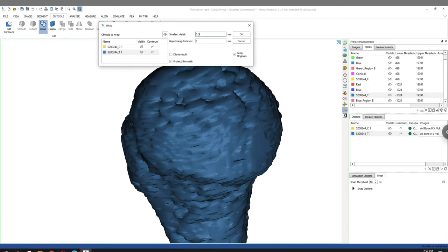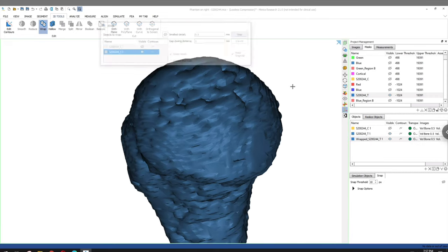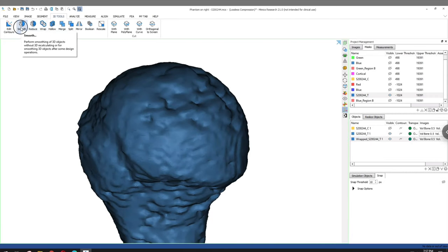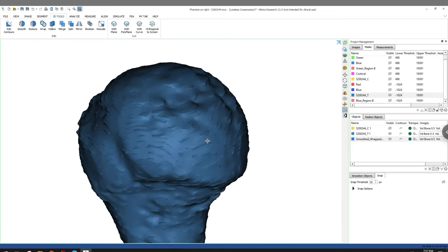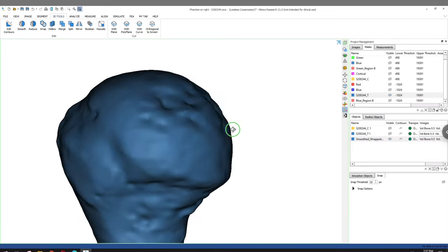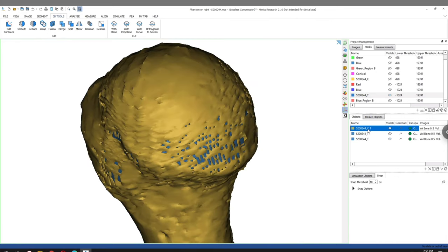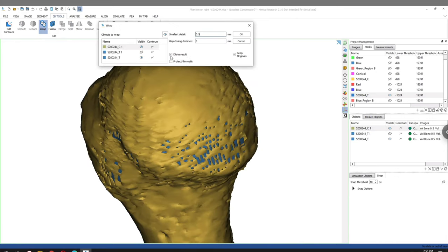So this would include these wrapping functions, and it's important also to make sure that you highlight that dilate result checkbox when you're performing the wrapping functions. And in the context of the smooth function, make sure that you deselect compensate shrinkage. And this is just because we want to limit the amount of interference between our cortical shell and our trabecular bone model.